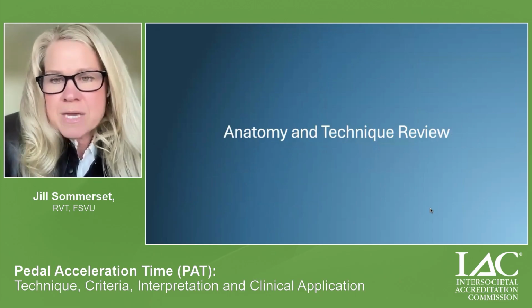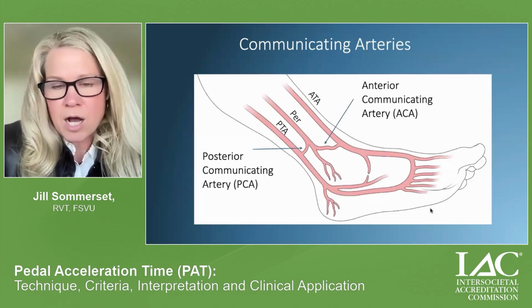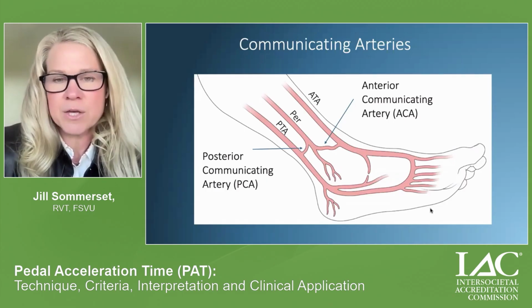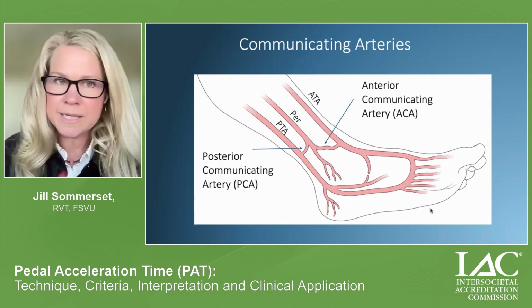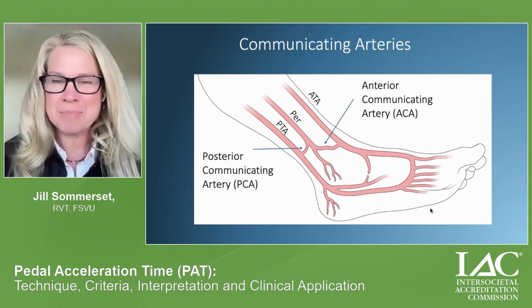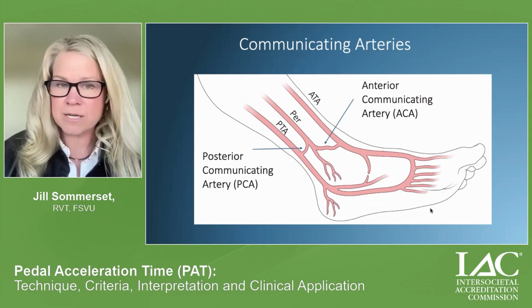So let's do the anatomy and technique review of pedal duplex ultrasound. Before we talk about PAT and the pedal arch, I really want to highlight the communicating arteries because I think they're underevaluated in the normal arterial duplex, and they can be incredibly helpful to really understand the hemodynamic pathway. I'm always thinking about the target artery pathway to the wound bed. So how are we going to get blood flow to that wound bed with an intervention?